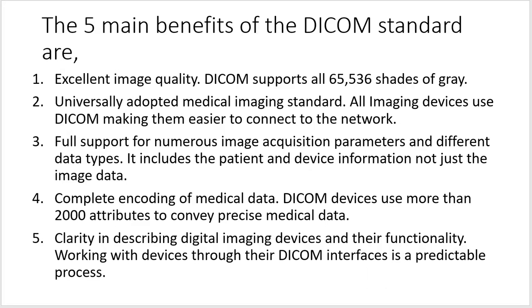The main benefits of the DICOM standard are this. It has excellent image quality. DICOM supports all 65,536 shades of gray. It is a universally adopted medical imaging standard. All imaging devices use DICOM, making them easier to connect to the network. It has full support for numerous image acquisition parameters and different data types. It includes the patient and device information, not just the image data. It has complete encoding of medical data. DICOM devices use more than 2,000 attributes to convey precise medical information.